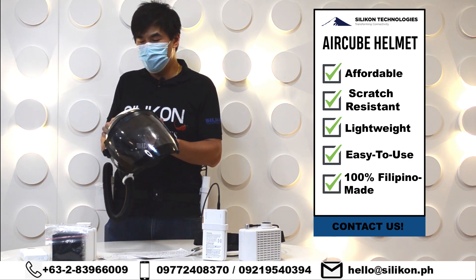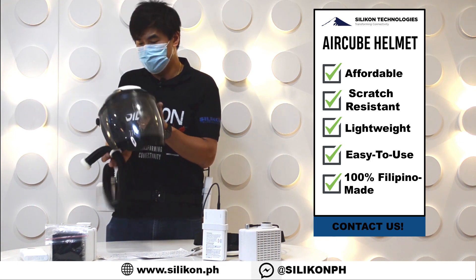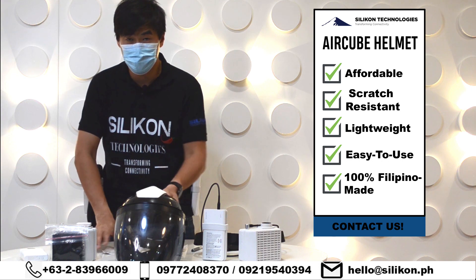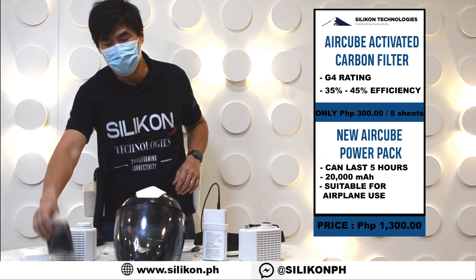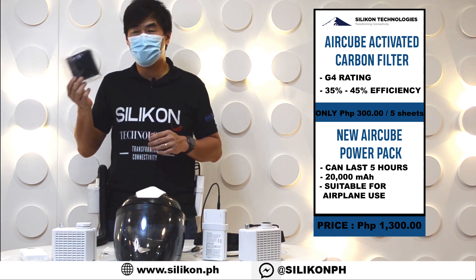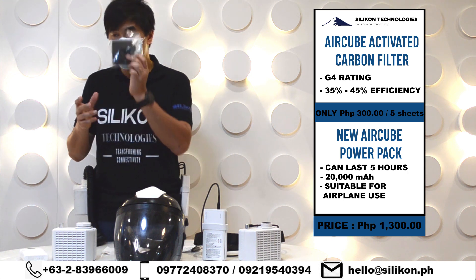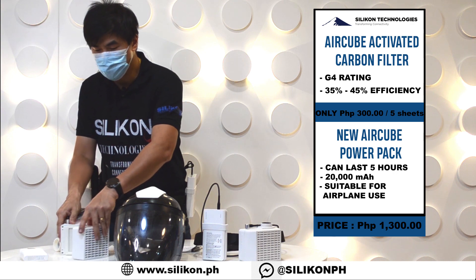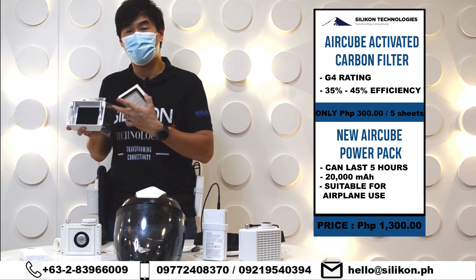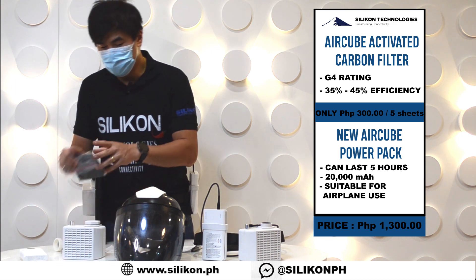In addition to the helmet, in early to mid-June we also announced a secondary filter to go with our HEPA filter. Certain doctors want to use a carbon filter to filter out gases and fumes. What we have now is a pack of five activated carbon filters. This activated carbon filter has a G4 rating with 35 to 45 percent efficiency, made from organic coconut shells. To connect it to your Air Cube, you simply insert the activated carbon filter between the grill and the HEPA filter — very easy to use.